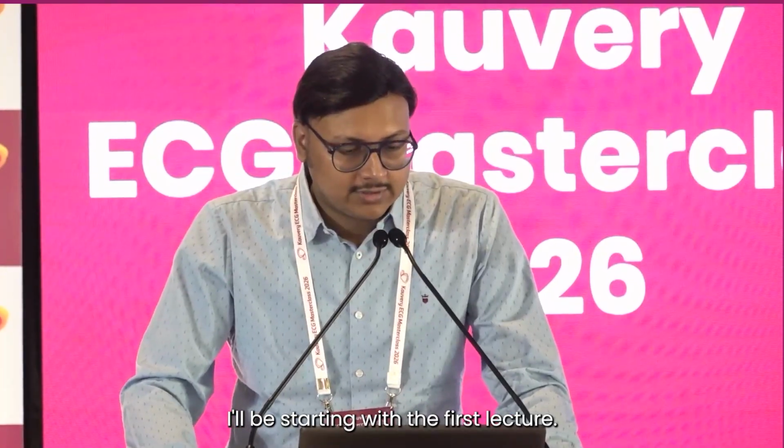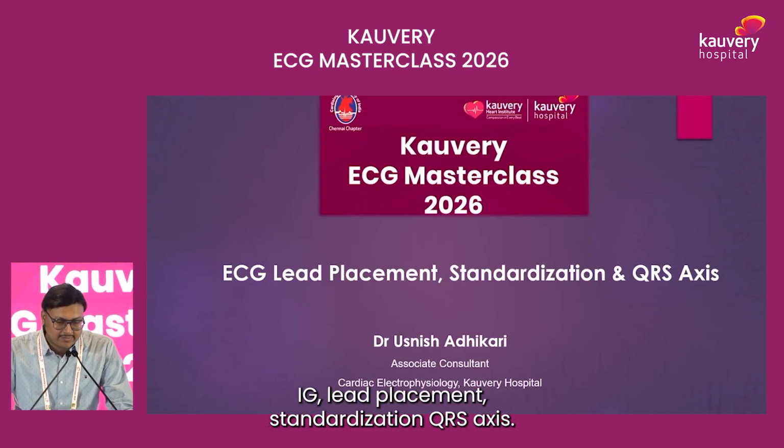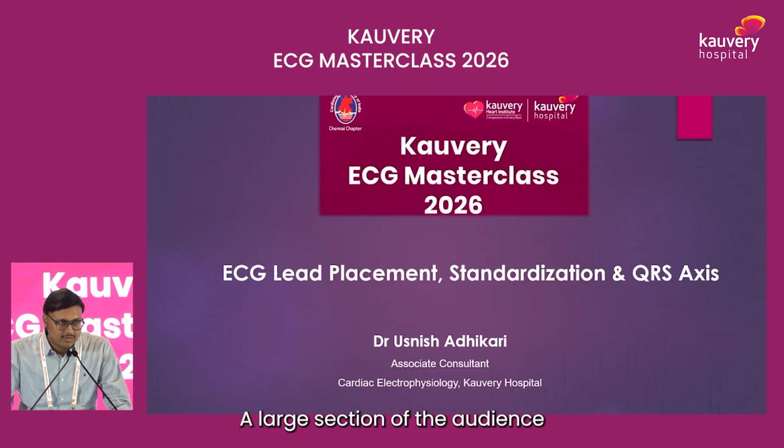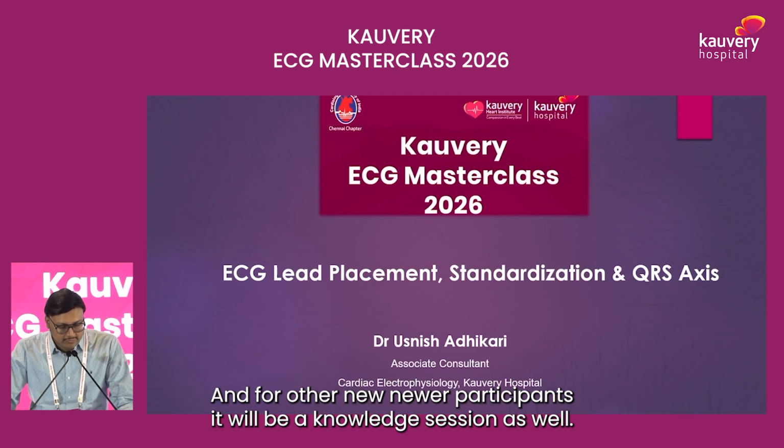I'll be starting with the first lecture, that is, the basics of ECG lead placement, standardization, and QRS axis. A large section of the audience would probably know a lot of this, but it's just a refresher course, and for newer participants, it will be a knowledge session as well.